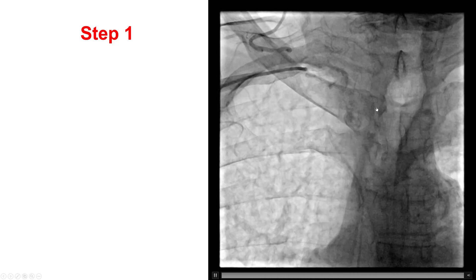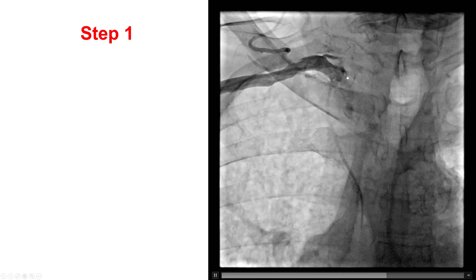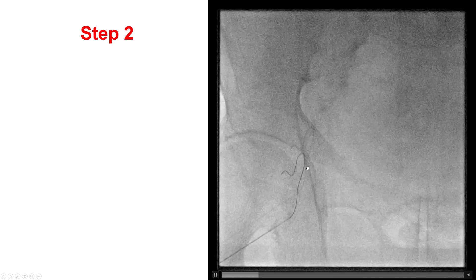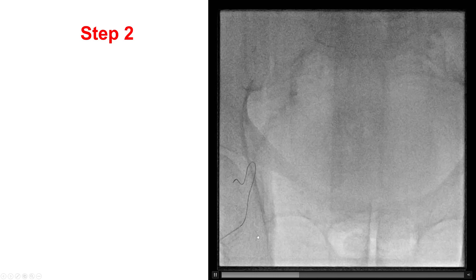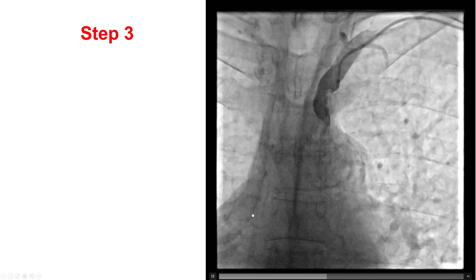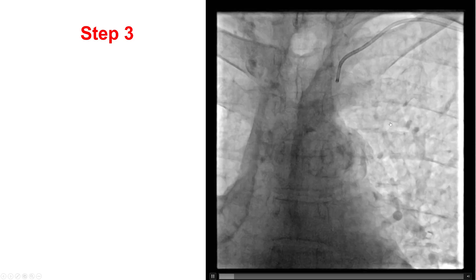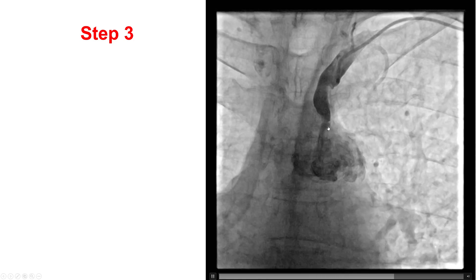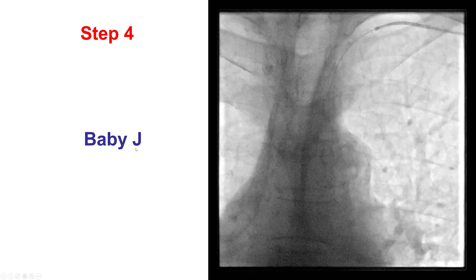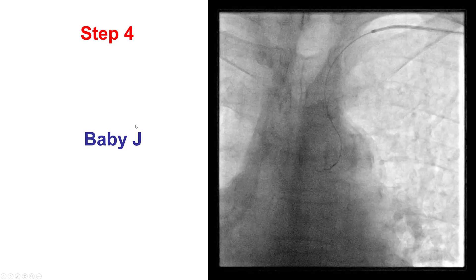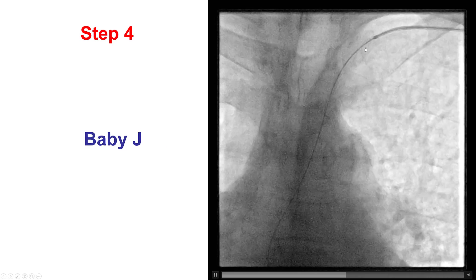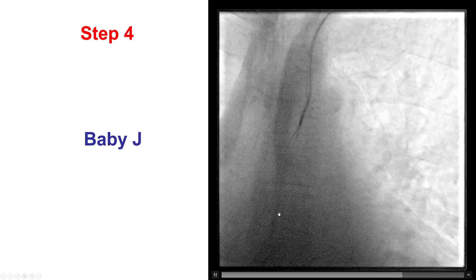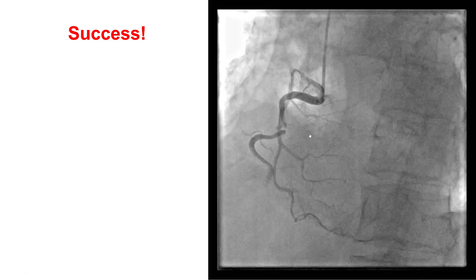This is another example in which we originally started from right radial, but the right subclavian was occluded. This was a vasculopath — we tried femoral but were unable to get through. Finally, we went left radial and were close to the aorta; however, there was a subclavian lesion at the ostium. We used a polymer-jacketed wire — a glidewire Baby J — which eventually made it all the way down to the aortic root, and then we were able to advance our catheters and perform angiography and PCI.